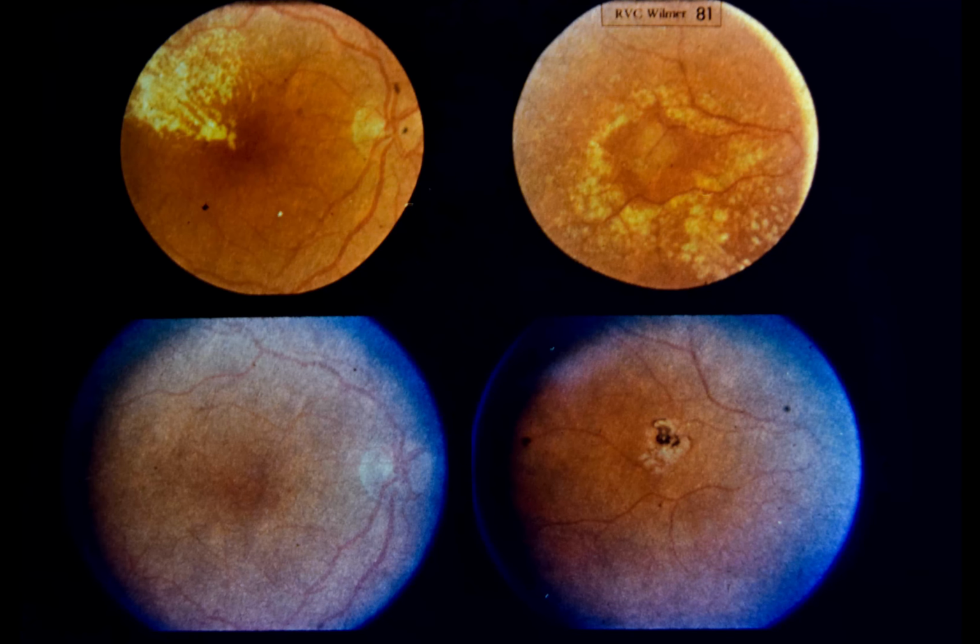Slide 81. Photocoagulation treatment of retinal arterial macroaneurysms. This 70-year-old female was illustrated in slide 80. Upper left, note marked lipid deposition in the macula prior to photocoagulation treatment. Visual acuity was 20/200. Upper right is a photograph taken immediately following argon laser photocoagulation treatment.